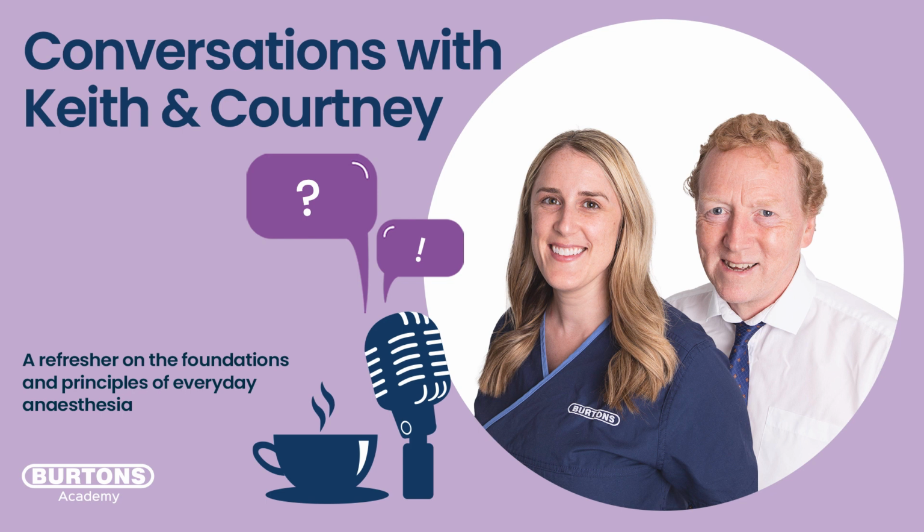And there we are. Then you look at your capnograph, and you look at your patient, and if that 10 centimeters, for whatever reason, isn't giving you sufficient chest inflation, and or your capnograph is showing an elevated end-tidal CO2, then you moderate the rate and or you moderate the pressure. We'll come back to what you do in response to CO2 values not being where they want to be.